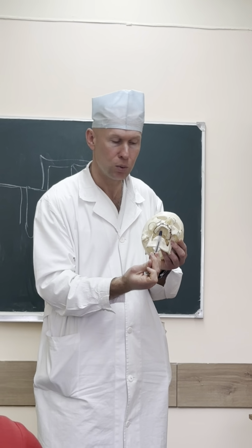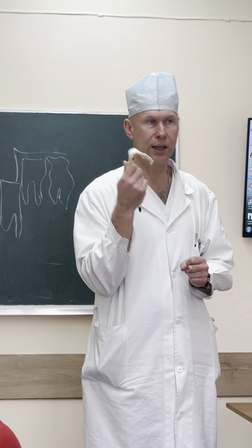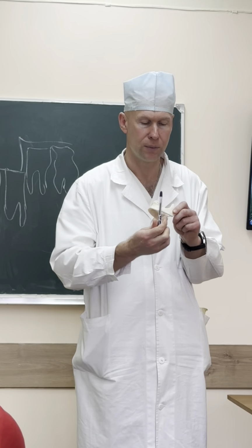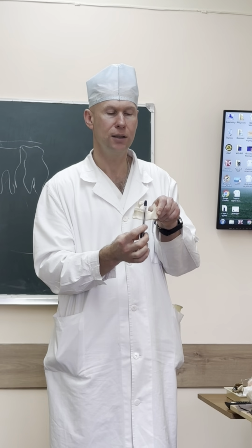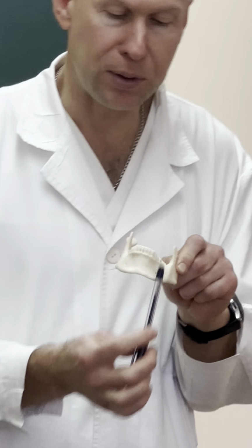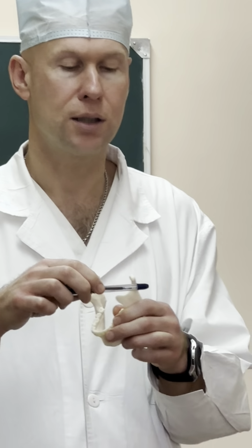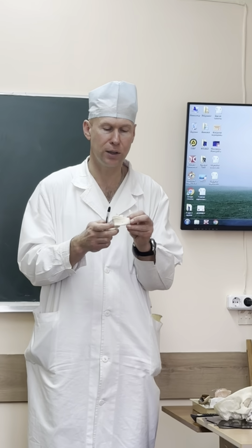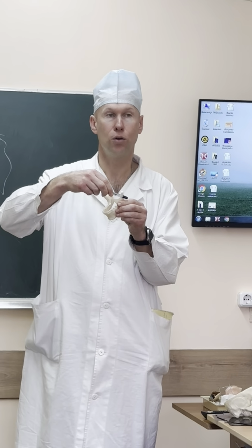Why here? Because there are 4 typical places of fracture of the mandible. The first place, angulus of the mandible, here. Second place, foramen mentale. We can see the fracture line here. Third place, middle line. And finally, processus articularis. If you try to find a fracture of the mandible, you should look in these places: first place, second place, third place, and fourth place.